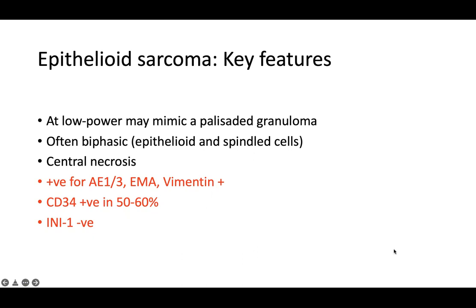There's been times where people have tried to work up epithelioid sarcoma compared to other types of sarcomas, and they found INI1 was diffusely positive, and so that made them feel very strongly that they're not dealing with an epithelioid sarcoma, because it's so statistically likely to have loss of INI1 in the nucleus of epithelioid sarcomas.